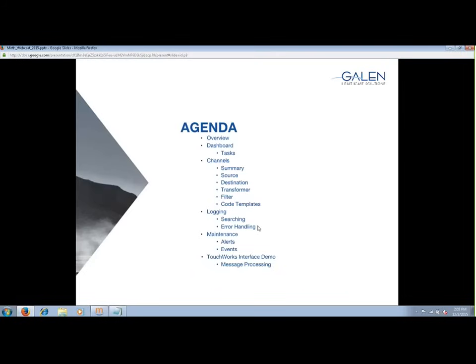I'm going to be presenting a brief overview of MIRTH while trying to highlight some of the more interesting and important features, along with a quick demonstration on how to spin up a basic channel. Then I'll be handing it over to Nate to go over logging and maintenance within MIRTH Connect, as well as some more advanced concepts of channel development that were utilized in the ConnectR to MIRTH migration work.